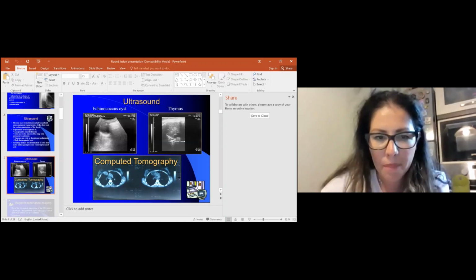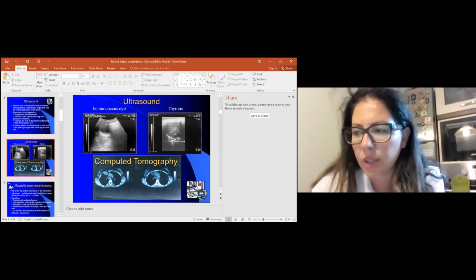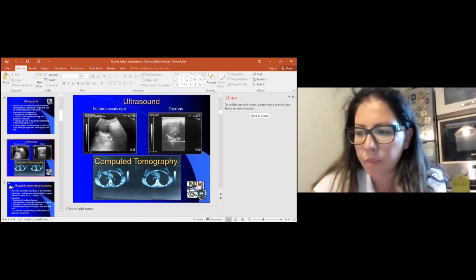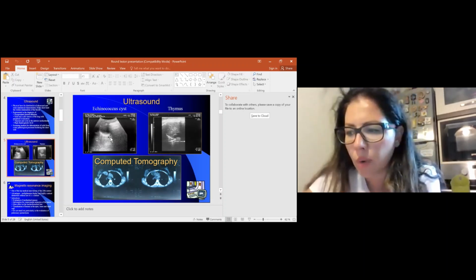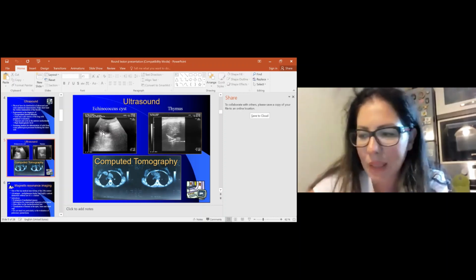wall. For ultrasound, we use 3 megahertz probes up to 7, with acoustic approach like intercostal, parasternal, transhepatic, etc. On this slide, we can see the thymus. We can see a round echinococcal cyst with thick wall and liquid substrate in the middle.